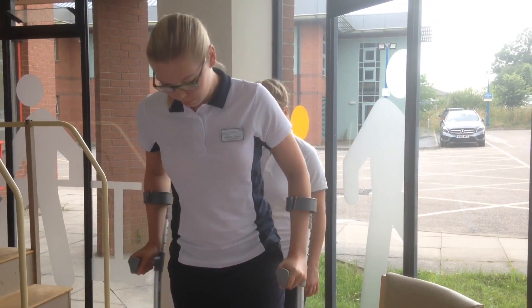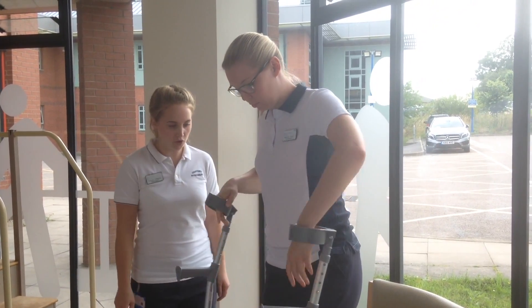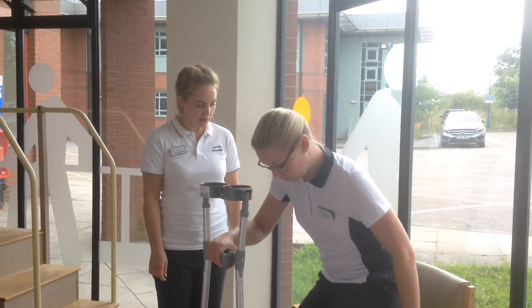Approach the chair backwards until you can feel it behind your leg. Make an H shape with your crutches again. Hold that, reach back for your chair and slowly lower yourself down.